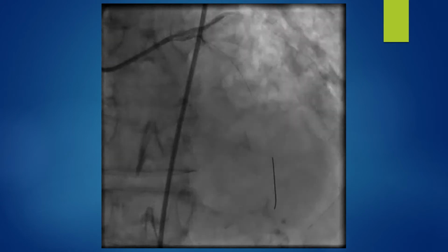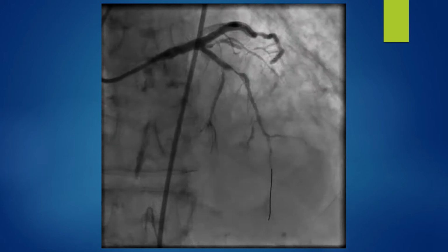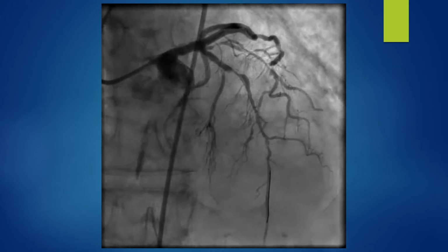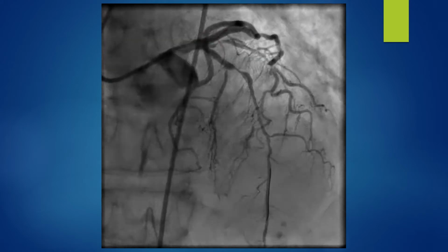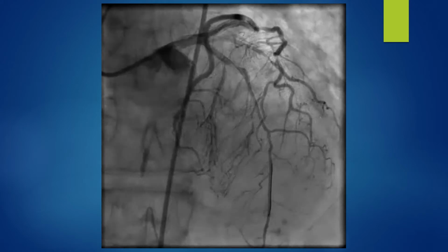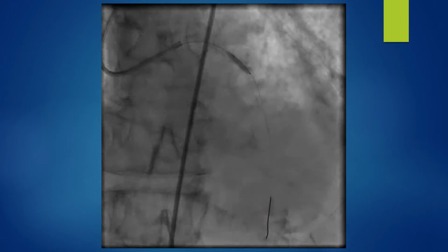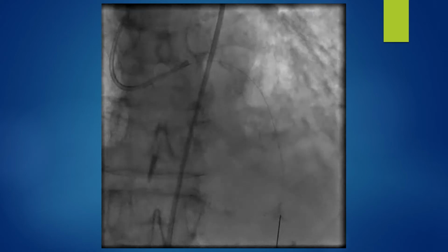This is the first shot after the orbital atherectomy, and you can see that the channel opened up a little more. As I mentioned in my previous videos, the goal for the orbital atherectomy is not to obtain luminal gain. The goal is to crack the calcium so we can have balloon inflation and good expansion of the stent. After the orbital atherectomy, I used a 2.5 by 12 millimeter compliant balloon, and you can see it inflated pretty well. This is the shot after the balloon inflation.